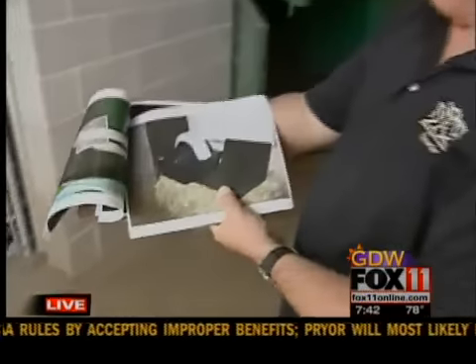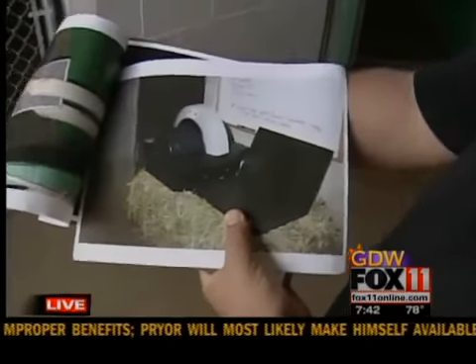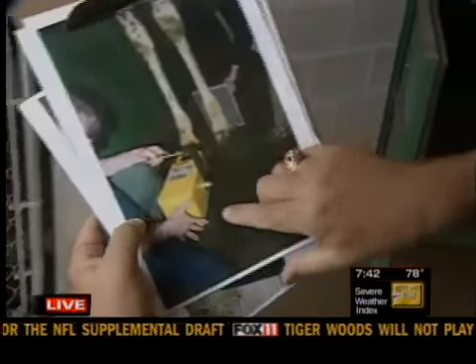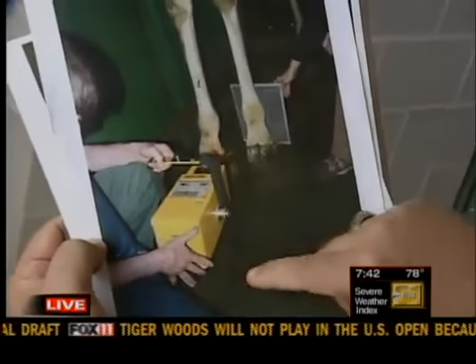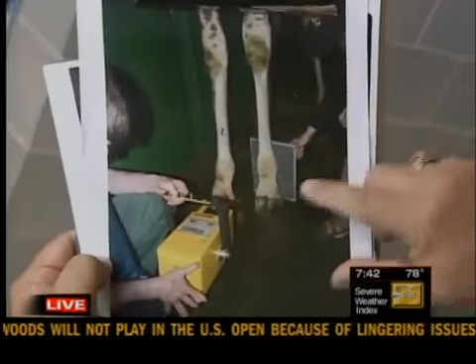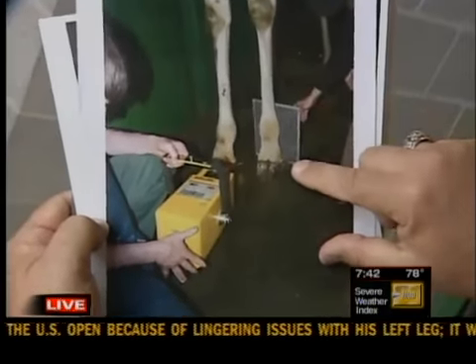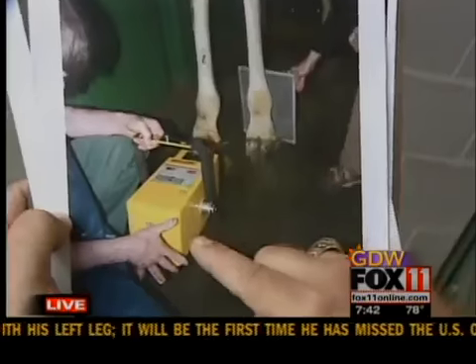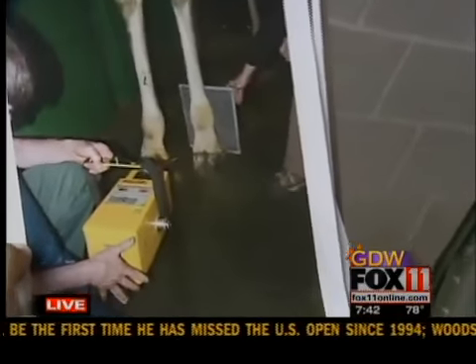So we had Dr. Schaefer come out, and here's the piece of equipment that he had. He had a digital imaging system. It's an X-ray system, and we don't have that piece of equipment here at the zoo. But you can take a look. Here's a picture of Dr. Schaefer helping Dr. Tracy Gilbert. As you can see, she's got the X-ray film behind there, and it's nice because we do this right on the facility. It's a portable X-ray machine, so it took some images.